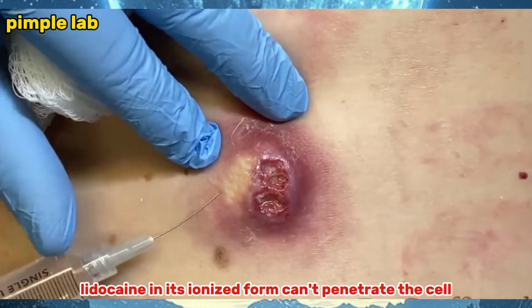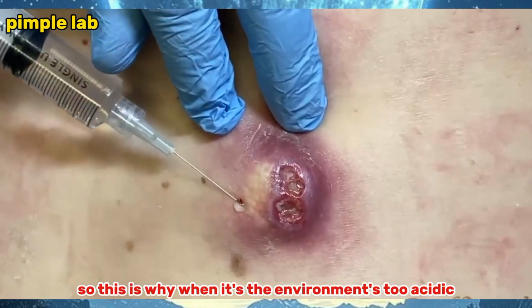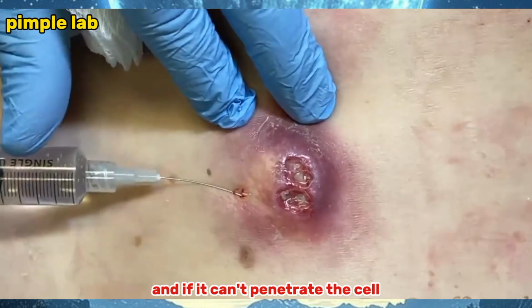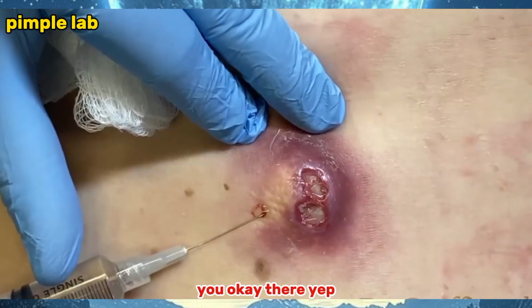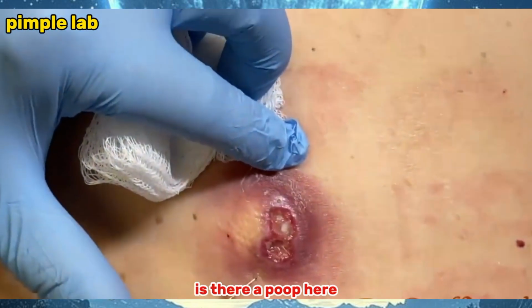So essentially, lidocaine in its ionized form can't penetrate the cell. Okay. So this is why, when the environment's too acidic, that's what ends up happening. And if it can't penetrate the cell, it can't affect the sodium gate, which is the mechanism by which that occurs. Are you okay there? Yeah. I feel a poke here.